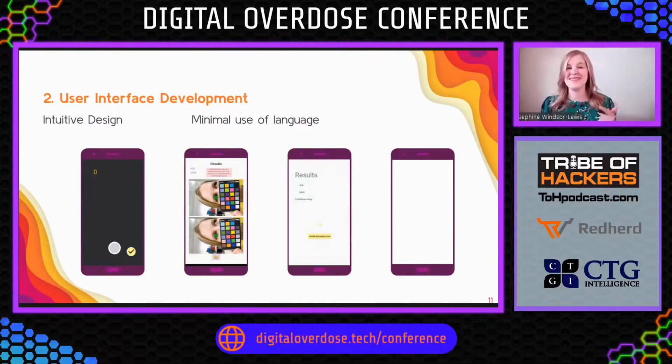Once you've done that, and you've done it a few times because this is science and we love to average things, you move on to the results screen. That's going to pop out a result from SCB, which is just a bilirubinometer reading and a diagnosis, because we want to make this simple for the end users. So it's going to say, does this baby need further investigation for jaundice? Yes or no, and a confidence reading, so that people can feel confident in the output of this app.